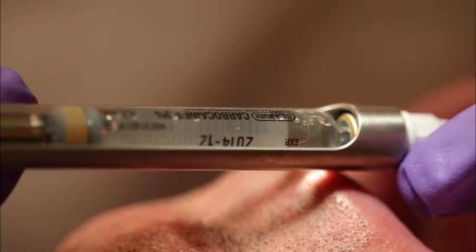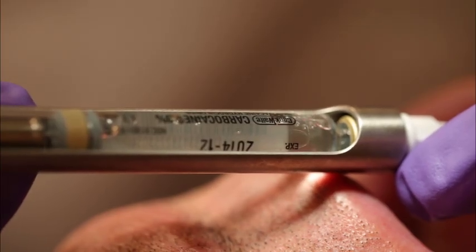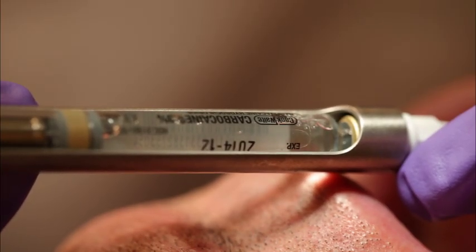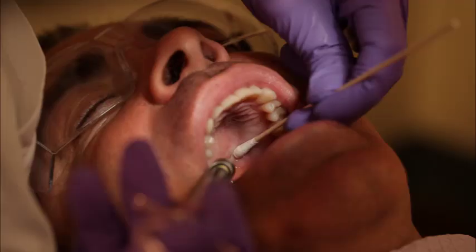Aspirate by pulling the thumb ring back gently 1 to 2 millimeters at the injection site to prevent the possibility of an intravascular injection. If the aspiration is negative, slowly deposit approximately 0.45 milliliters of solution, 1/4 of the cartridge, over approximately 20 to 30 seconds. Tissue in the area will blanch even further when the anesthetic is administered.